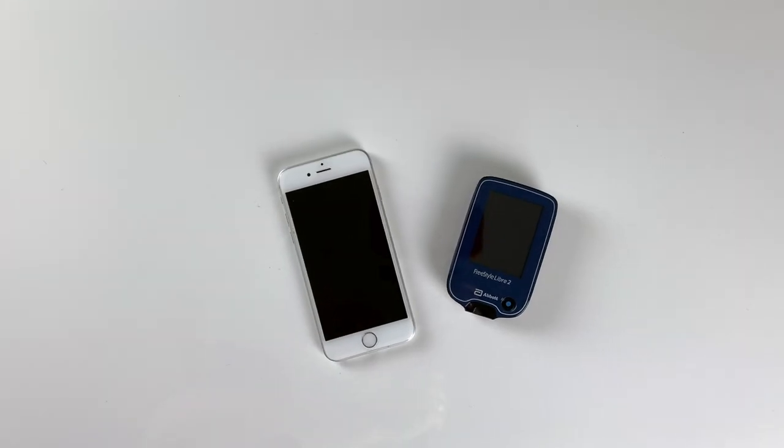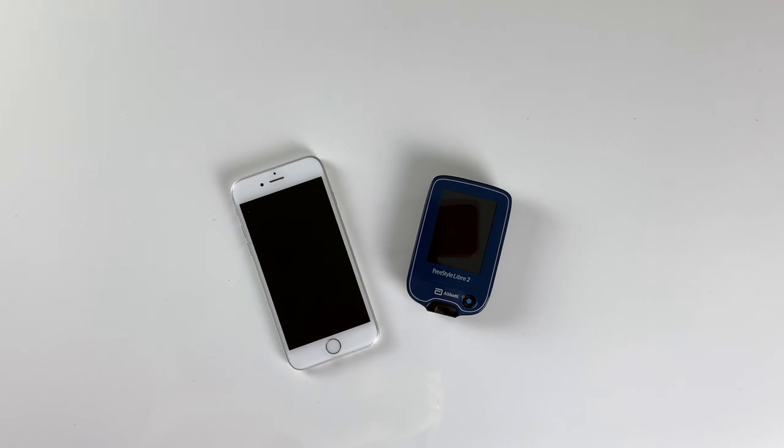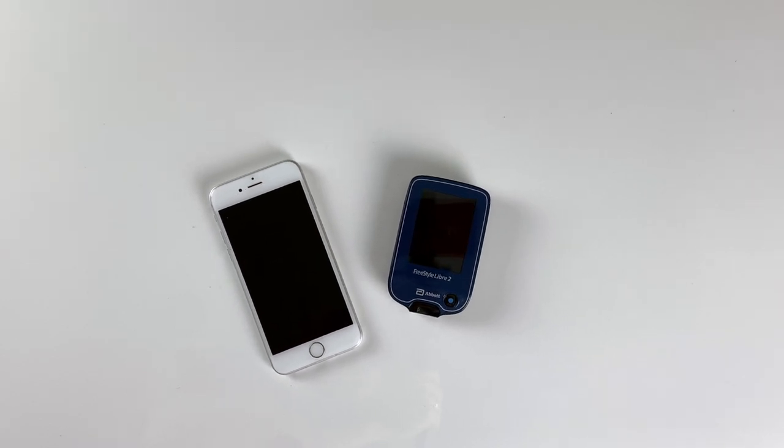You will not be able to receive alarms on both the reader and the phone at the same time. You need to pick one of these devices, and it's important that you activate the sensor with the device that you want to receive the alarms on. So if you want to get alarms on the phone, activate the sensor with the phone, and if you want to get the alarms on the reader, activate the sensor with the reader.